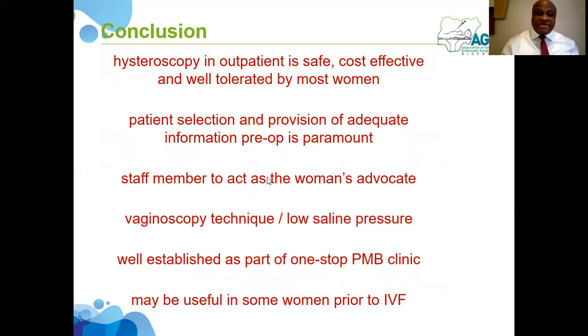You must have supportive staff who should act as a woman's advocate, and adopting the vaginoscopic technique with low saline pressure will help to reduce pain during the procedure. Hysteroscopy is well established as part of a one-stop post-menopausal bleeding clinic, and its role in IVF or women going through IVF remains to be established. I have a strong feeling that some group of women will benefit from having hysteroscopy prior to IVF.